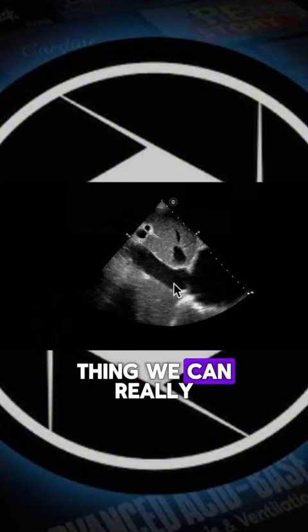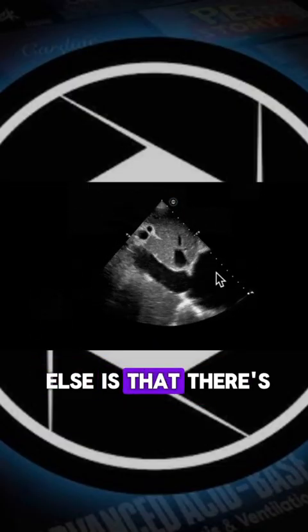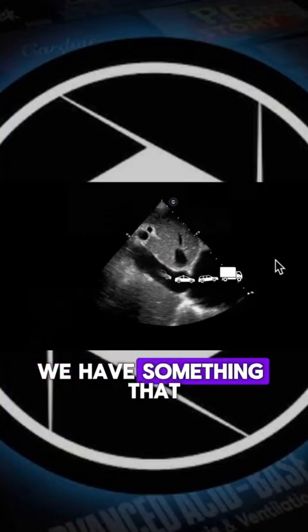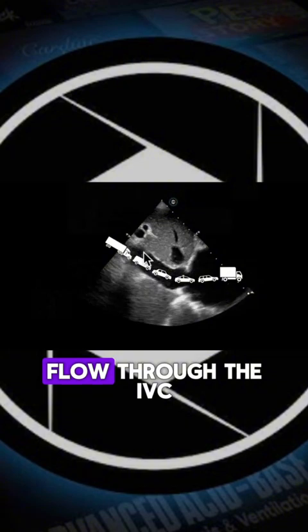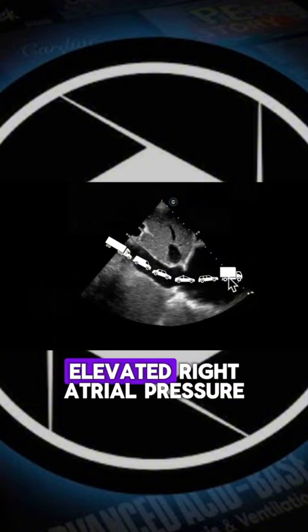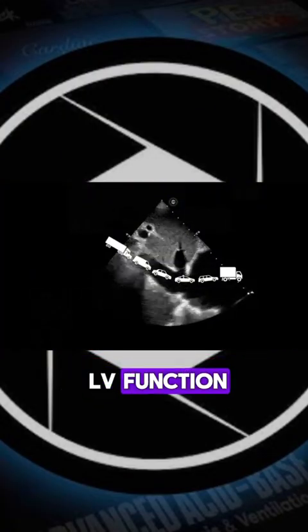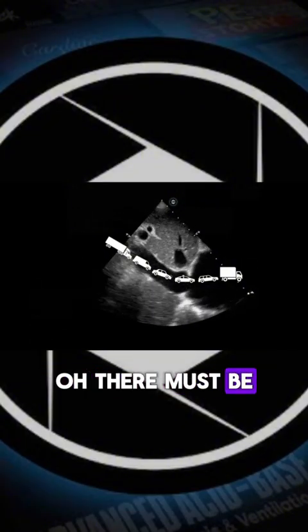And so the only thing we can really say looking at this, without looking at anything else, is that there's a traffic jam, right? We have something that is stopping or slowing down the flow through the IVC into the right atrium. So we could say this patient has an elevated right atrial pressure, but we really don't know why. This could be a pericardial tamponade, a pneumothorax. It could be a decrease in LV function, any of these things. We just see the on-ramp and we go, oh, there must be something that's clogging up traffic ahead.